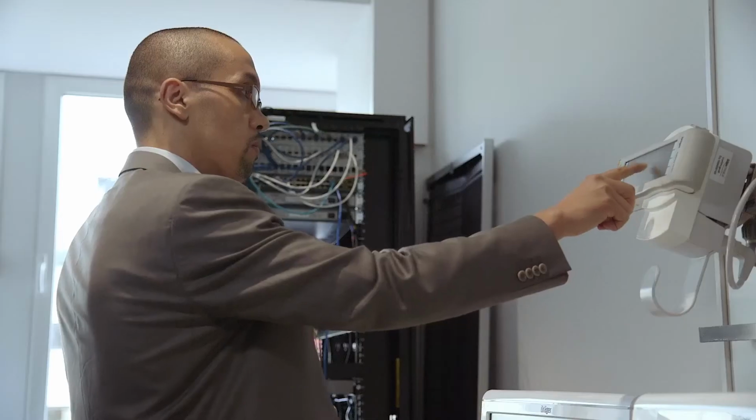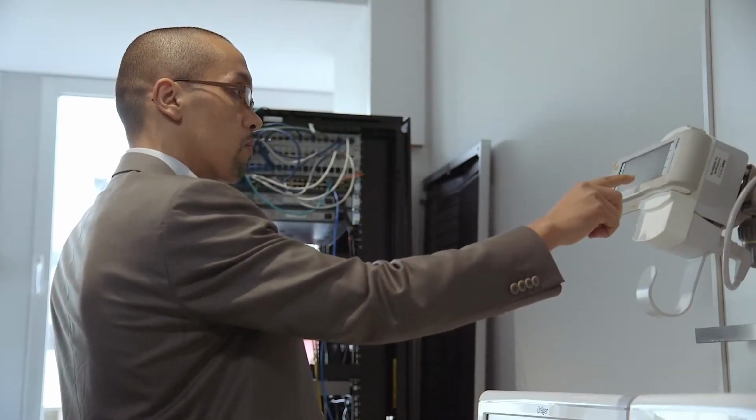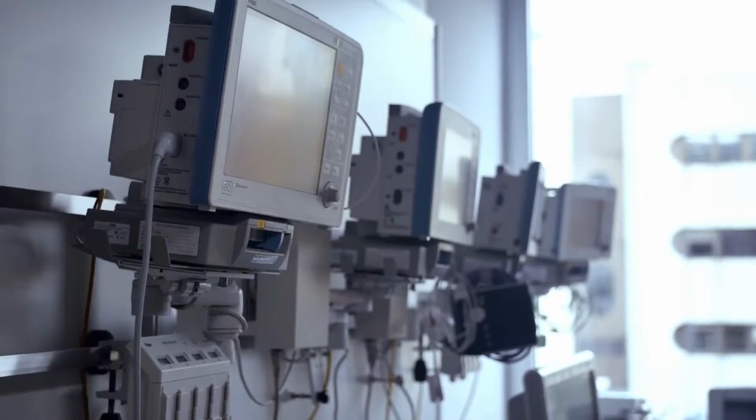Currently, for the communication between Dräger devices, we use a standard communication protocol, so it's a serial communication between devices. We collect information such as waveform, alarms, trends, and the settings coming from our ventilator, such as the Evita V500. When we need to communicate that information to our clinical information system, we use our Dräger Infinity network.